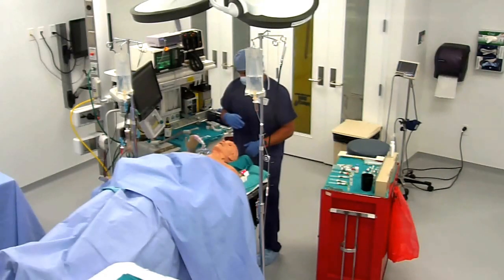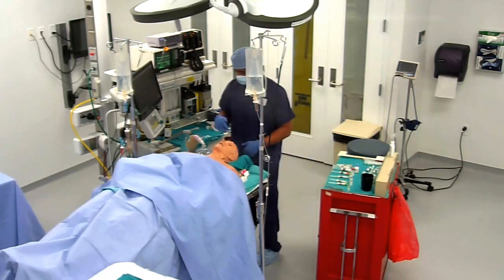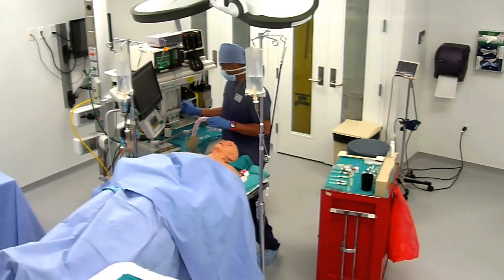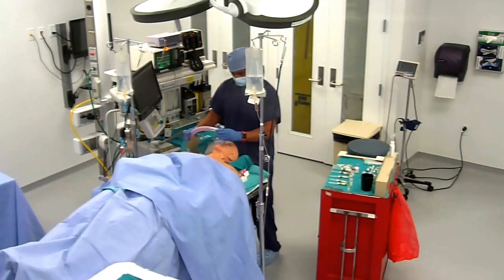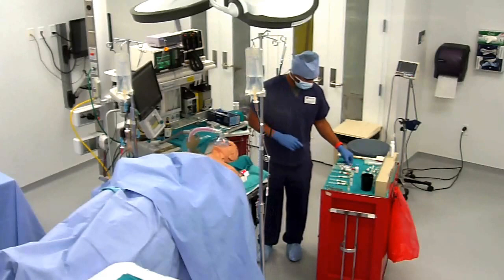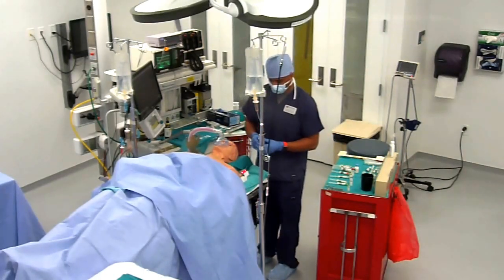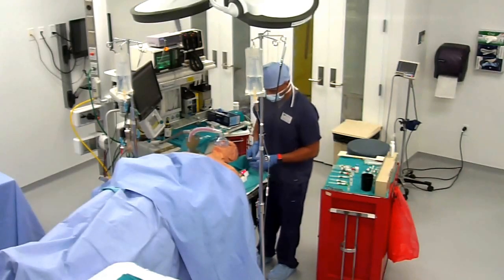So Katie, how are you feeling right now? I'm scared. You're scared? Okay, well I can do something about that. I'm going to put this mask on your face with 10 liters of oxygen, and we will pre-oxygenate your lungs, get your lungs nice and filled up with oxygen. And I'm also going to give you some medication to help you relax. This is called Versed, and it's going to help you relax. So I'm going to give 2 milligrams IV push of midazolam.